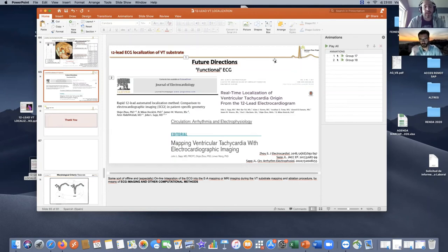Right. Do you think it's because of the ability of the 12-lead ECG as we use it today to detect this, and maybe future improvements in ECG technology, maybe ECGI in some way, could quantify or pick up low amplitude QRS fragmentation? I am pretty positive about that. That can be a major role of ECGI. But then we will have to reassess the whole diagnostic accuracy of this new ECGI-based criterion.